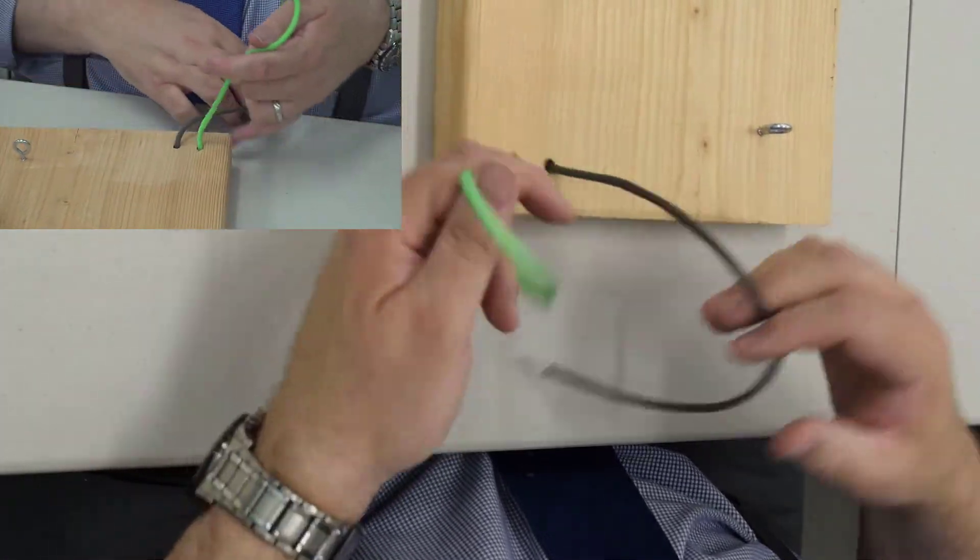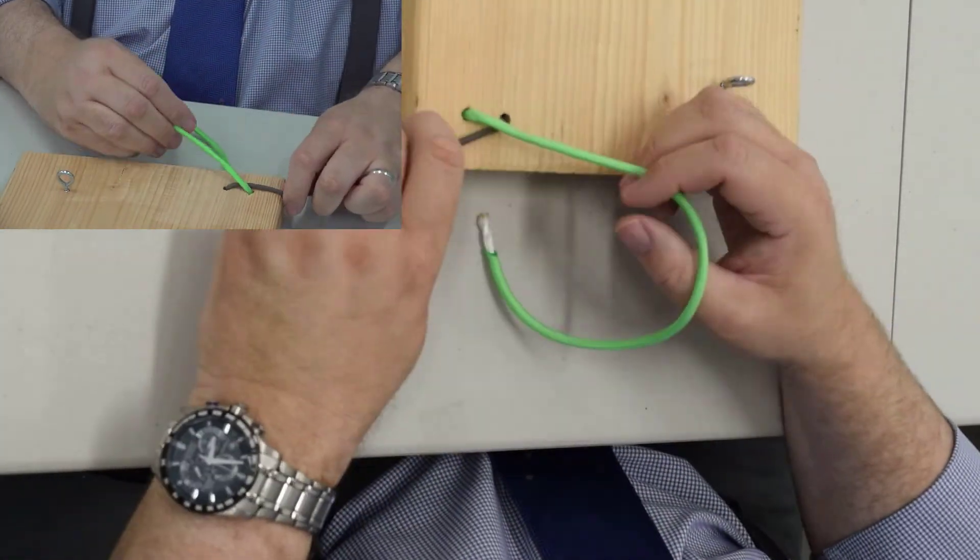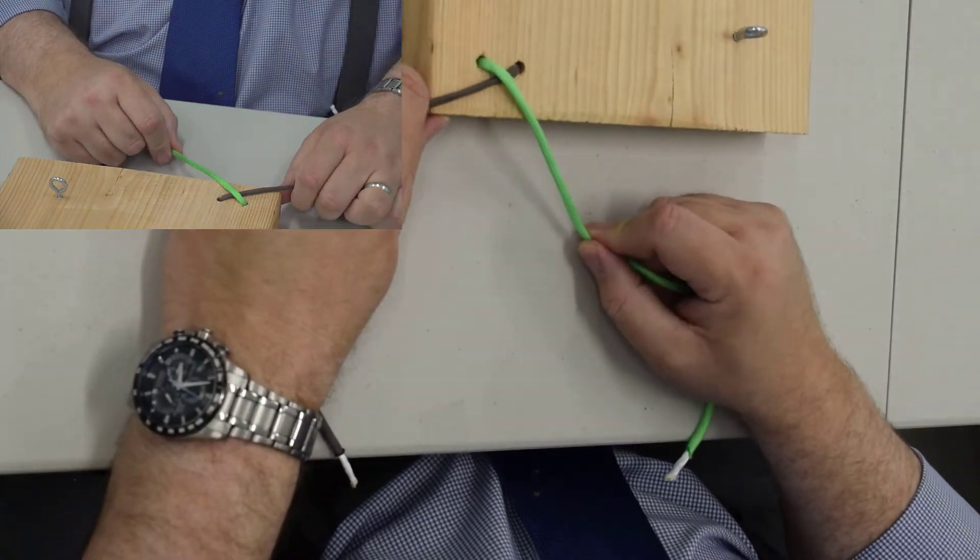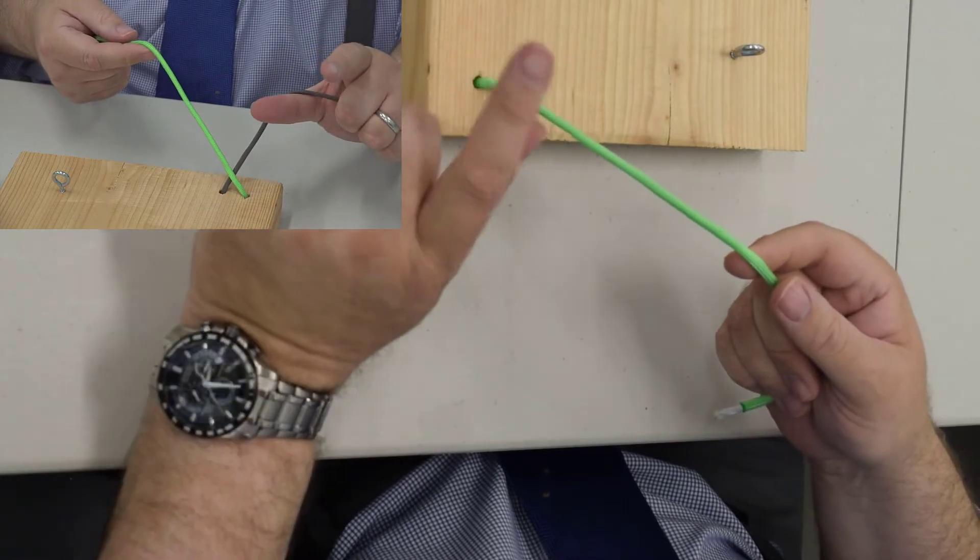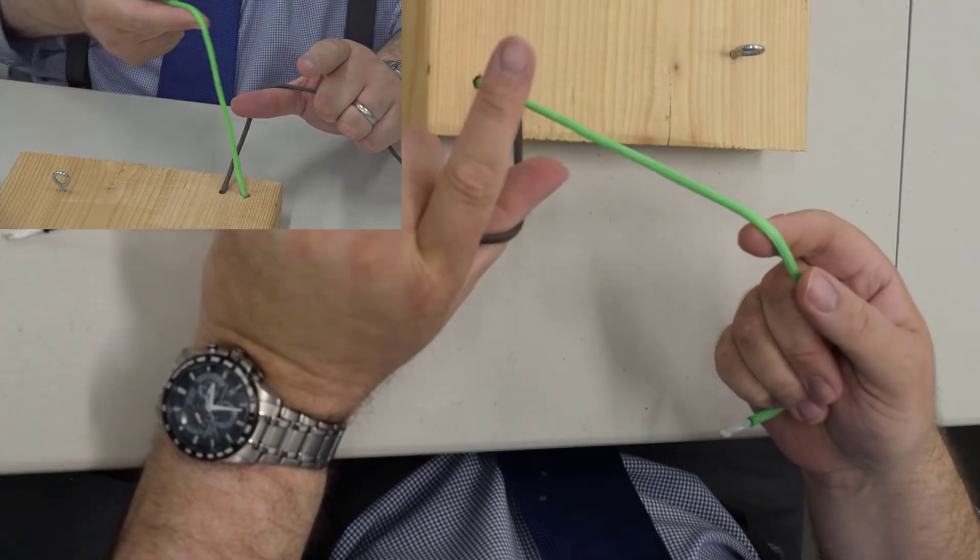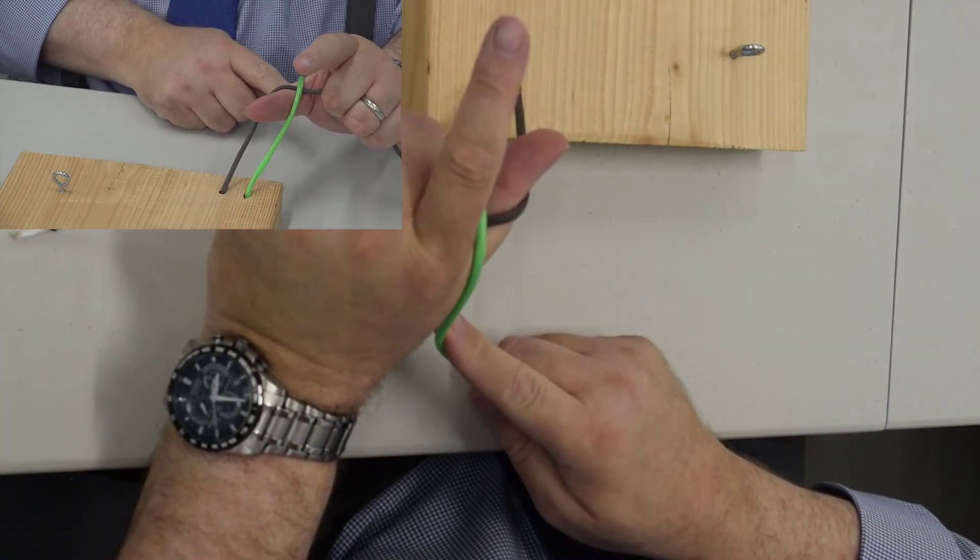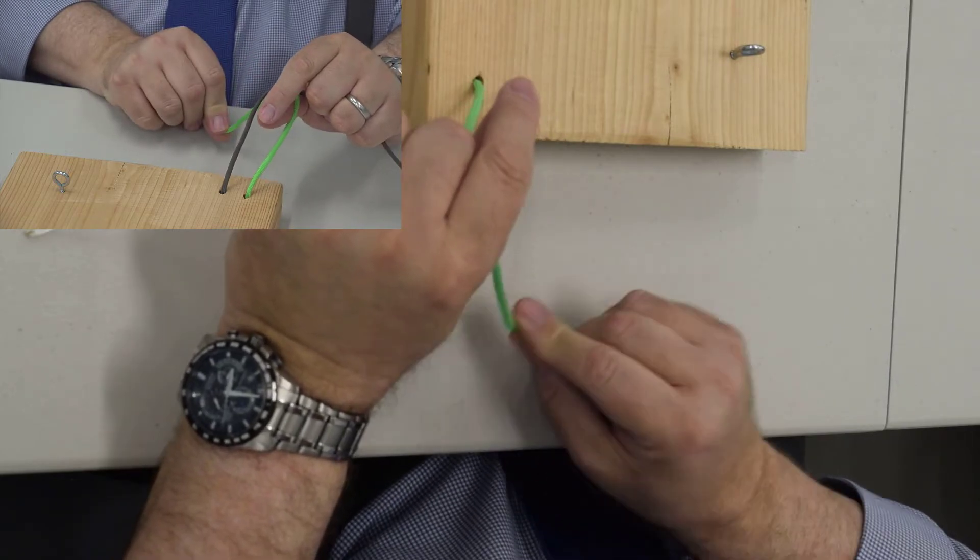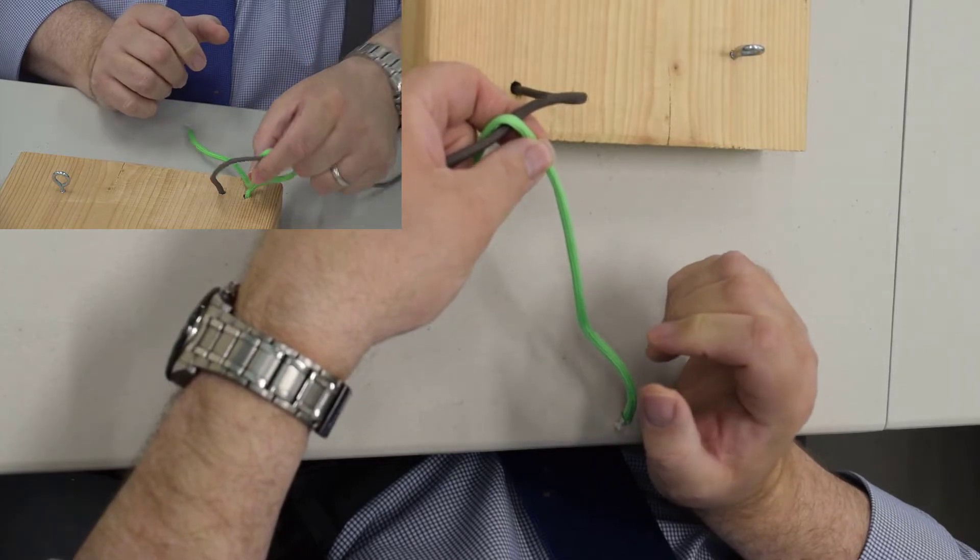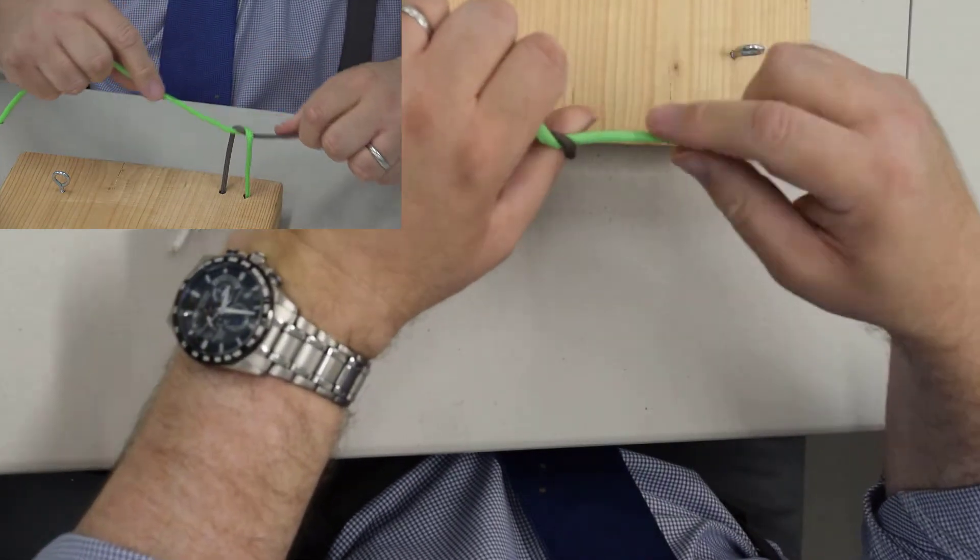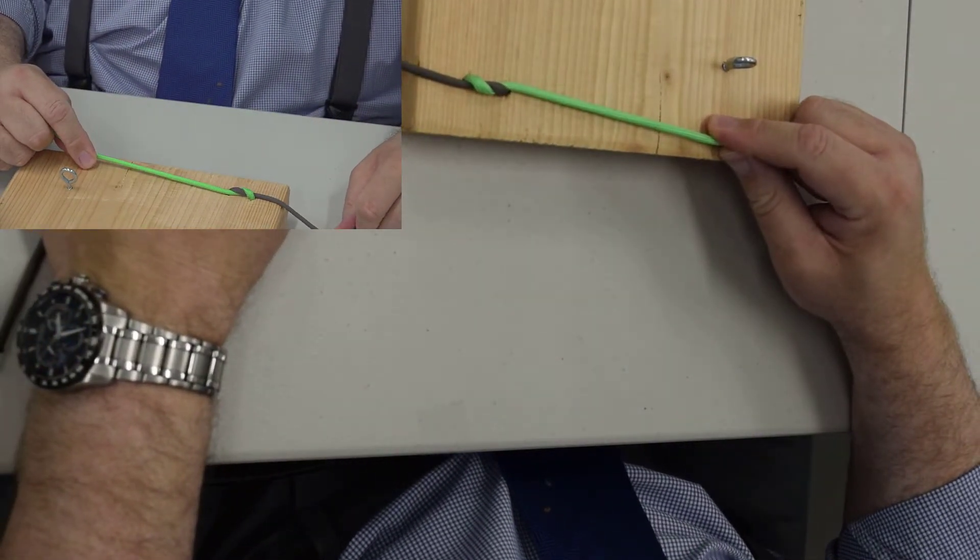What if I start with the green on top? If I start with the green on top, that's going to dictate now, instead of using the gun, that I use the half hitch that's with my thumb. Cross over the thumb, pinch, rotate down, hand the stitch to myself, rotate back through. Nice, pretty knot.